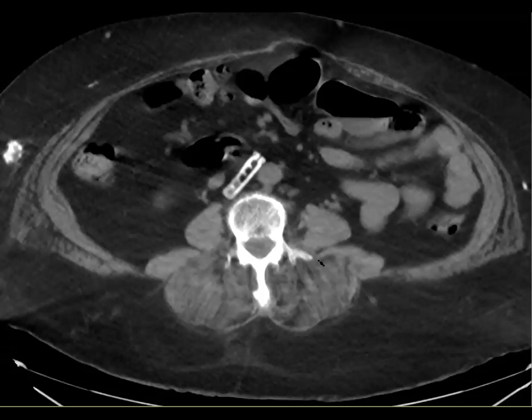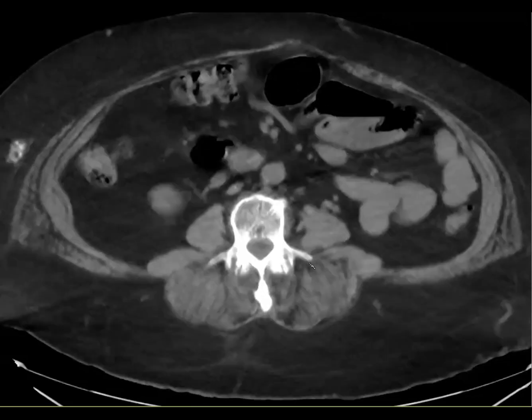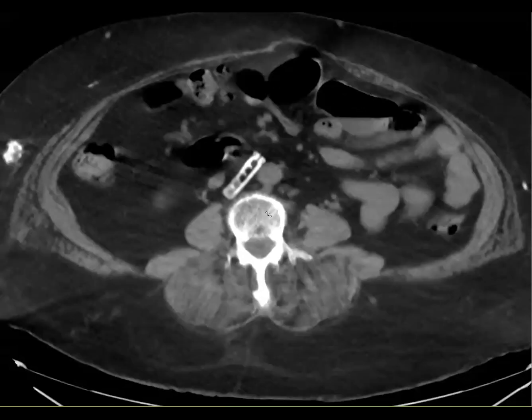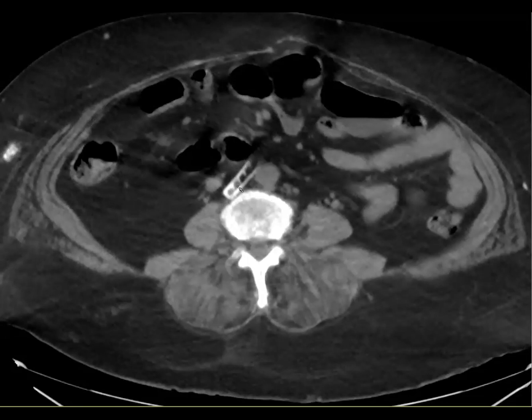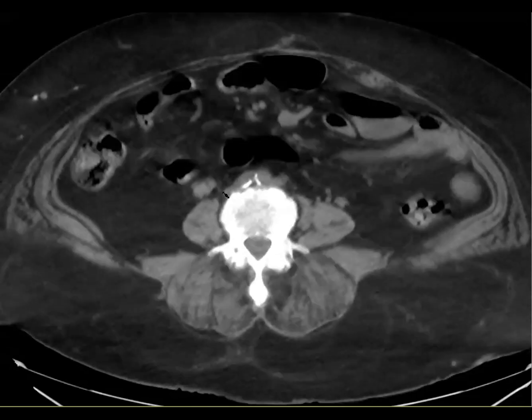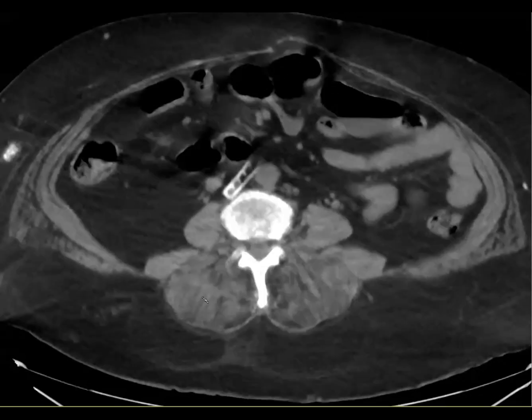I like just calling it an IVC clamp or clip, but it was actually invented by these two guys, Adams and DeWeese, in the 1960s, and they wrote a retrospective paper about it in 2011, I think, about how they came up with this. They tested it out on dogs, but basically this was before there were intravascular IVC filters, and they had this kind of serrated clip that would allow blood to still go through, but would capture the larger clots. Unfortunately, this clip caused a lot of issues, like in this case, where it basically obliterated the IVC in a lot of patients.